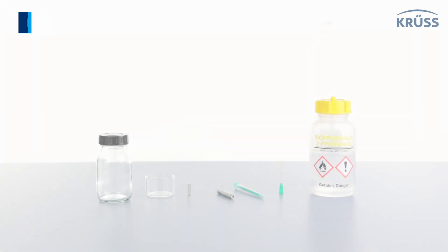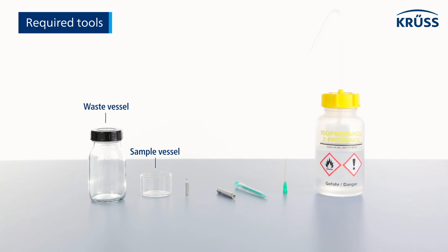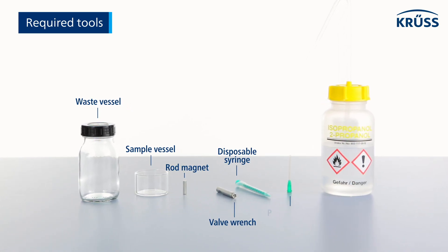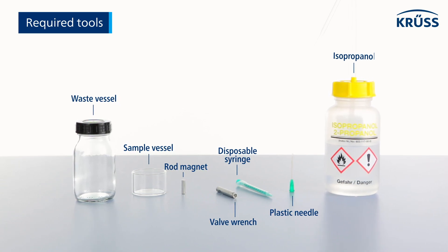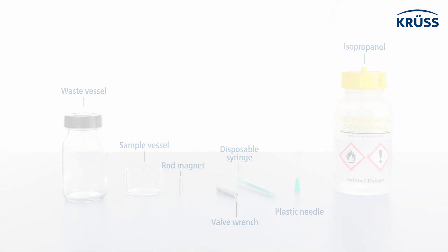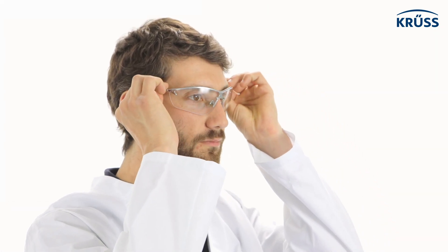Required tools: waste vessel, sample vessel, rod magnet, valve wrench, disposable syringe, plastic needle, and isopropanol. Before you begin cleaning, put on safety glasses and safety gloves.